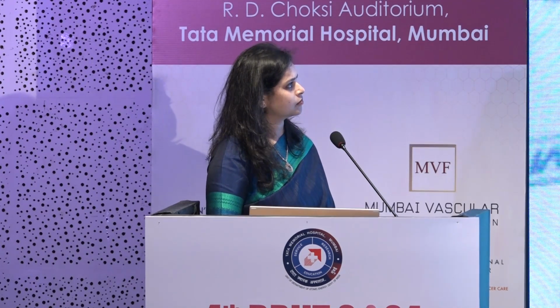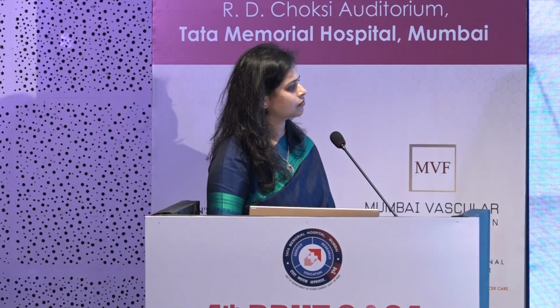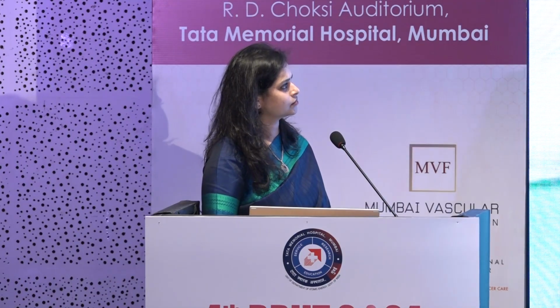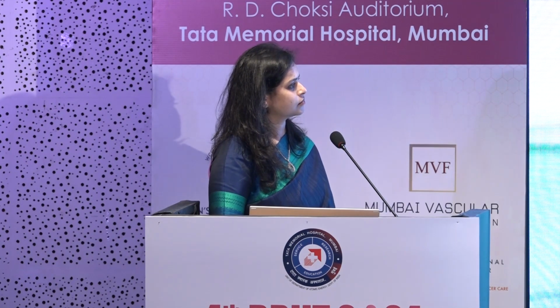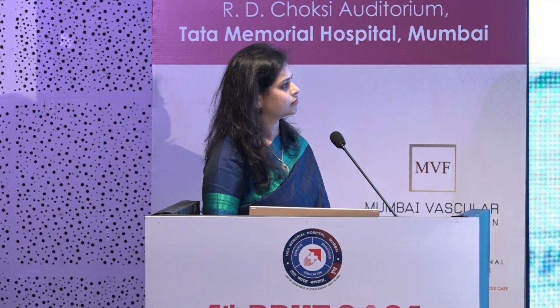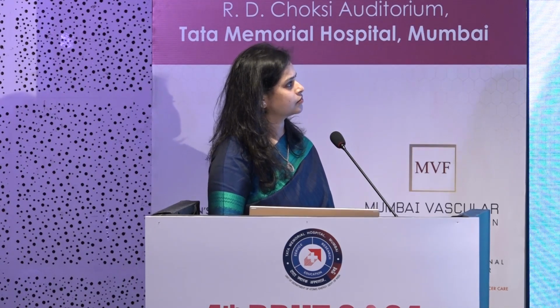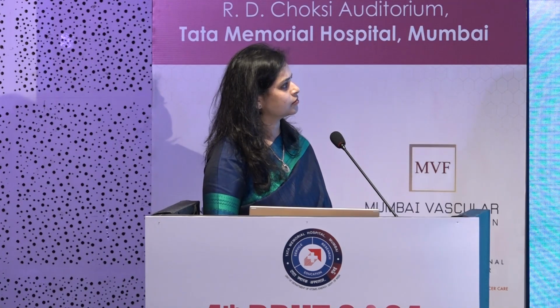At every point, we hold the cannula so that if it is loose fitting or if the stopper loses its grip at any point of time, it is not going to slide out. And then we replace with the obturator. This is a Vizilab obturator, filled with an MRI-compatible, MRI-detecting contrast agent. And the tip that we saw is this line, just a little below the tip. This is where the zero marking begins, and the zero marking marks the center of the target.